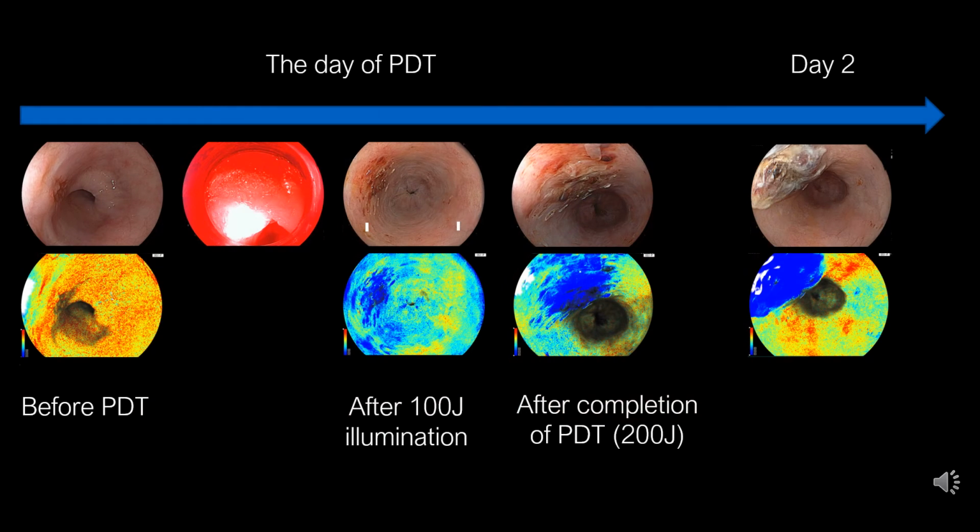This shows white light and OS images on the day of PDT and the following day. We were able to obtain endoscopic images that displayed dramatic changes in the hypoxic status immediately after PDT illumination.